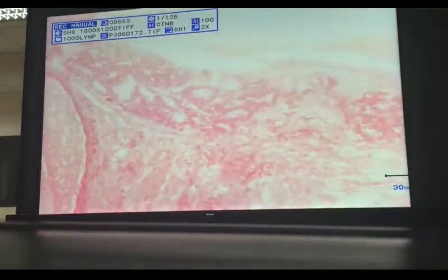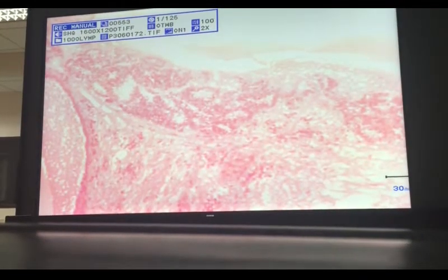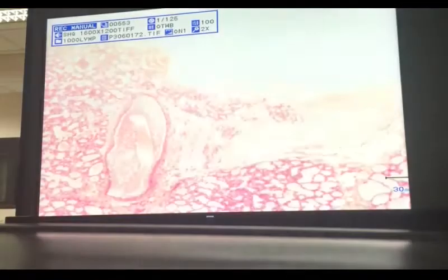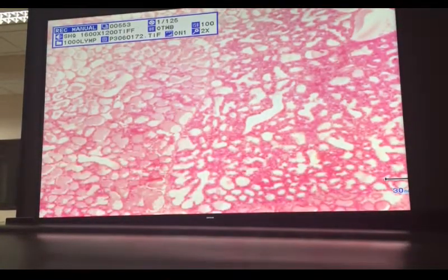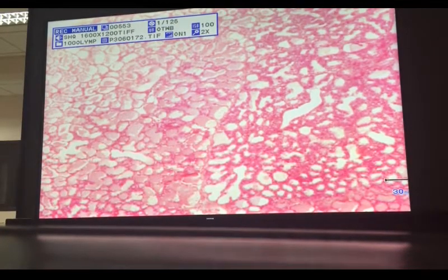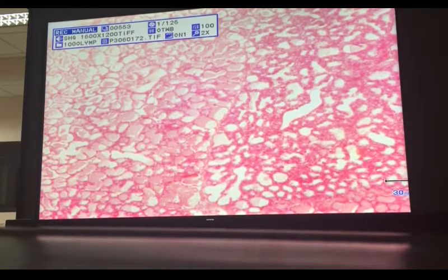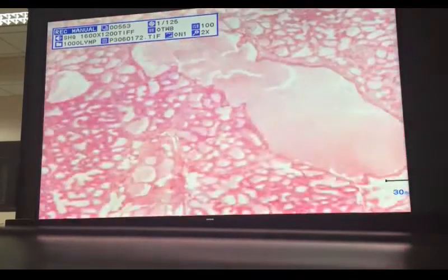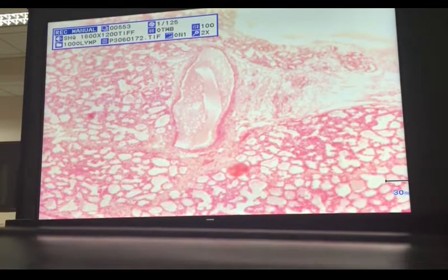Now, that is the histologic appearance of an inactive lobule of acini of the mammary gland. The rest of the field, the rest of the tissue, will show us lobules of acini which are actively producing milk. So look at the increased number of acini per lobule. And then look at also the increase in the size of the individual acinus.